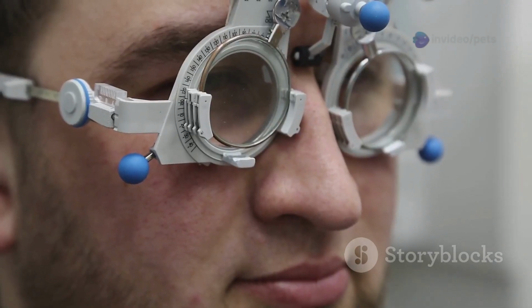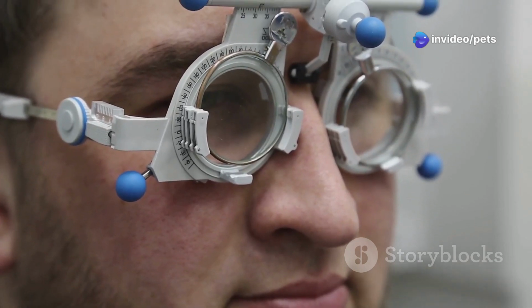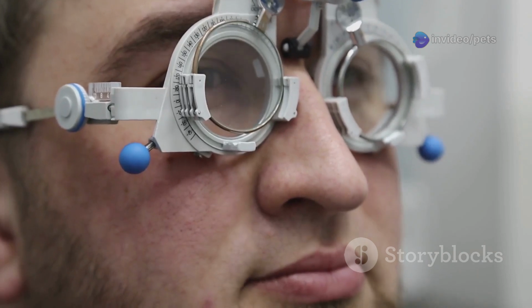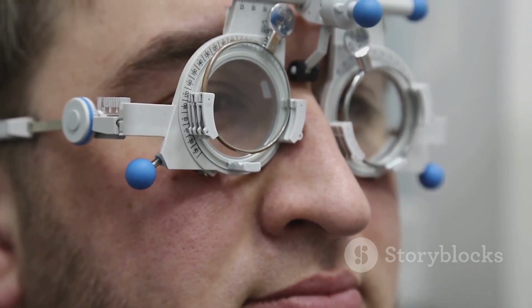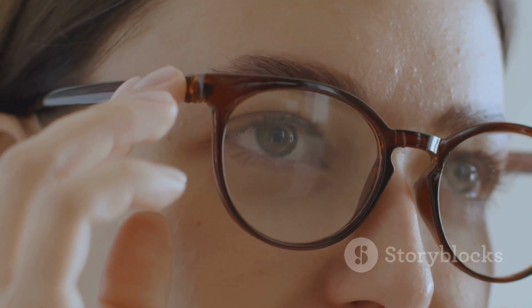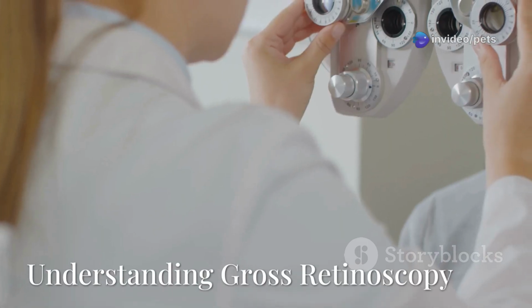The information obtained from retinoscopy, along with other tests, helps the optometrist determine the patient's refractive error and prescribe the appropriate corrective lenses if necessary. This objective measurement forms the foundation for clear and comfortable vision.